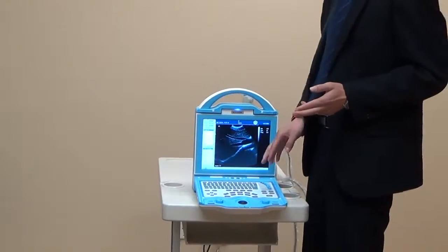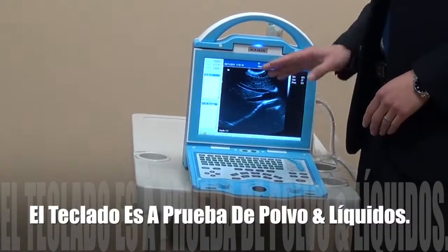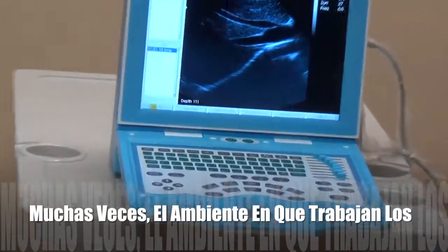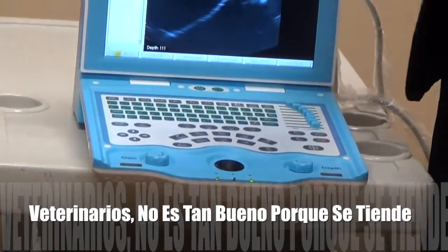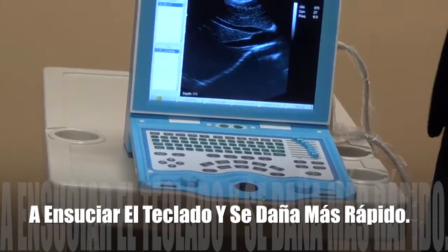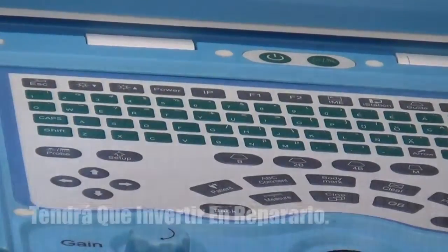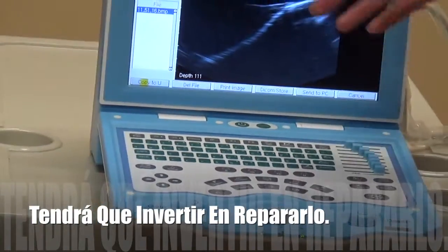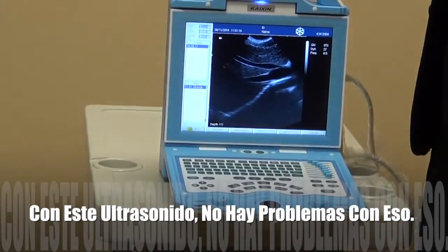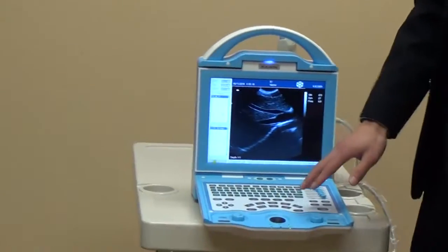Another advantage is the keyboard. This keyboard is anti-dust and anti-splash. For veterinarians, the working environment is sometimes not ideal, so the keyboard is very easy to get dirty. With a regular keyboard, water can get inside and cause it to short out, requiring expensive repairs. But this one is anti-dust and anti-splash. Also, with its backlight, you can see the keys very clearly while working in a dark room.